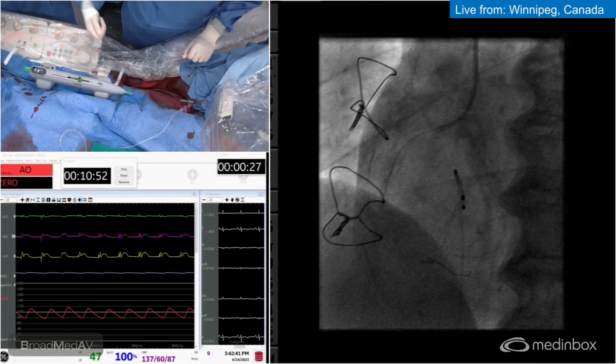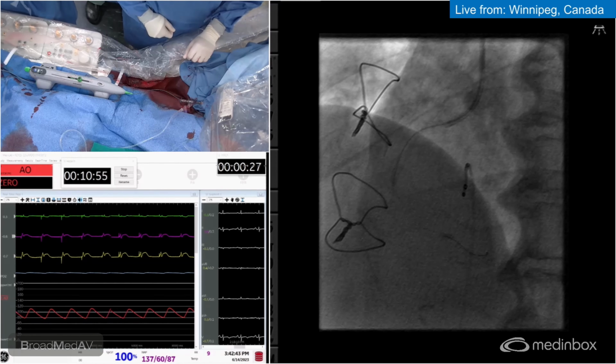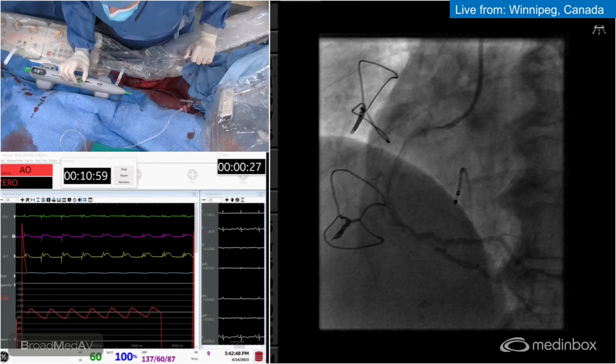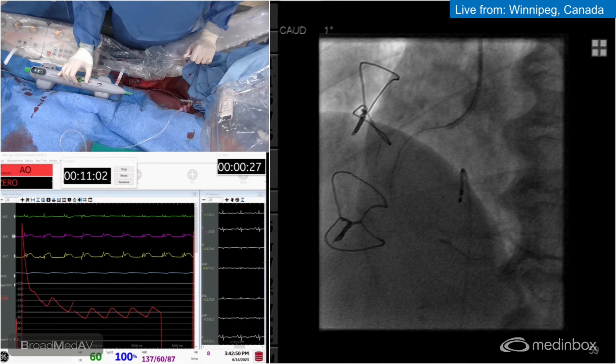You can see on the monitor there are some ST changes there. Might be obstructive. We got reasonable flow on puffs there, so we haven't really caused a lot of no reflow. The lesion itself looks like it's expanding.